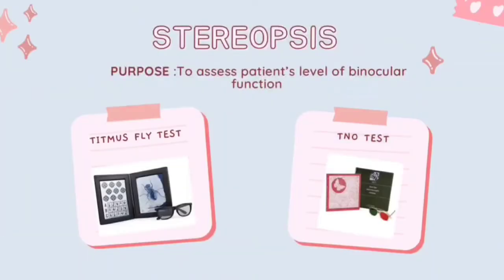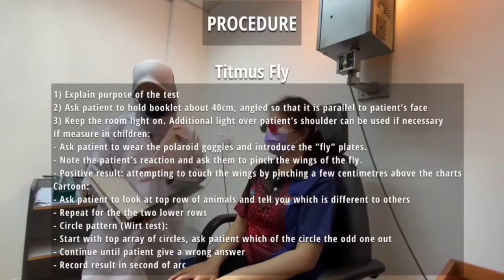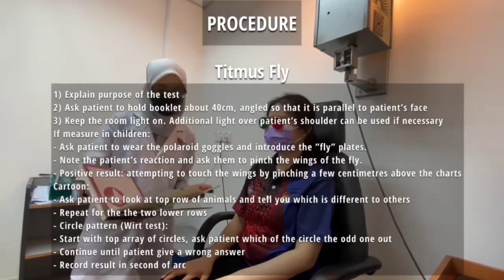Stereopsis is to evaluate the patient's level of binocular function and depth of perception. Examples of stereo acuity tests that we use in the BV clinic are Titmus fly test and TNO stereo test. The procedures of doing Titmus fly test and TNO stereo test are shown here.